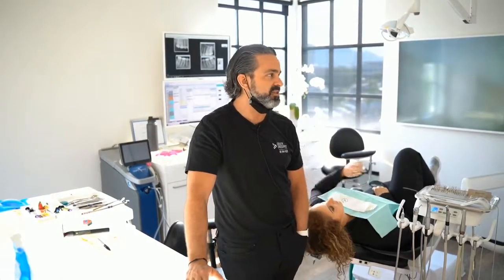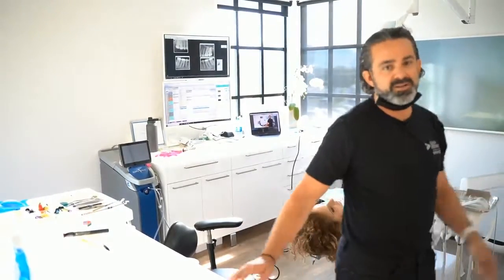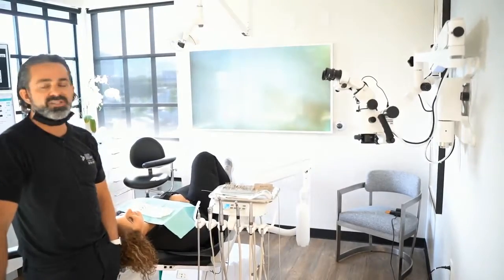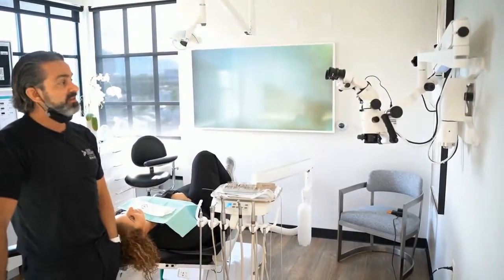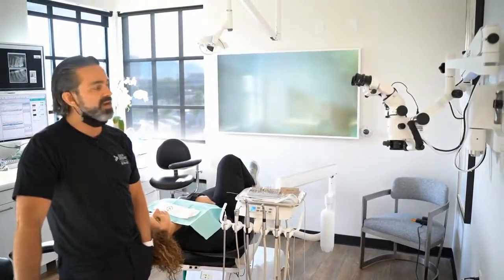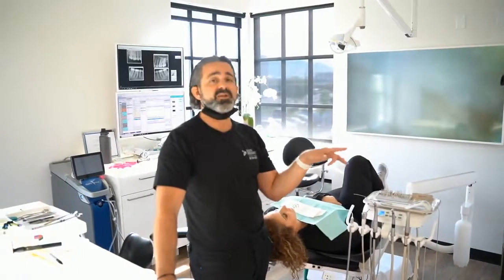Ergonomics, understanding the details of these ocular extenders, understanding the methodology behind beam splitters. You can make mistakes without experience in that, and hopefully me talking out loud lets you see how my brain works and why some of these details are important.